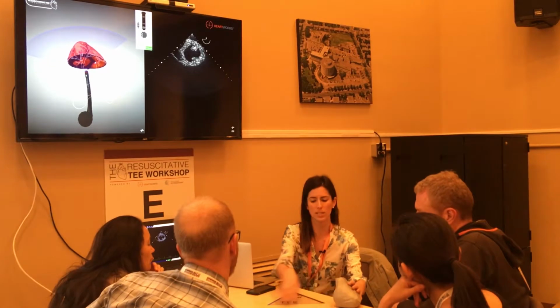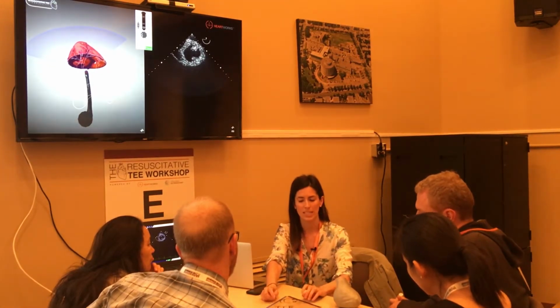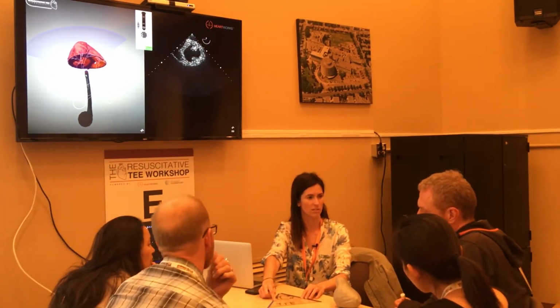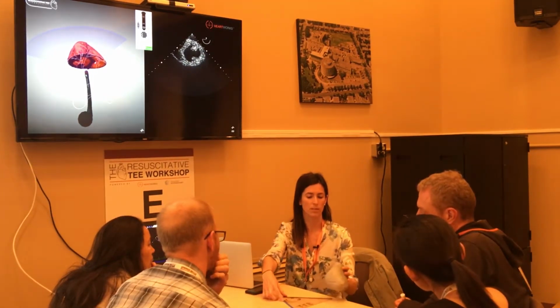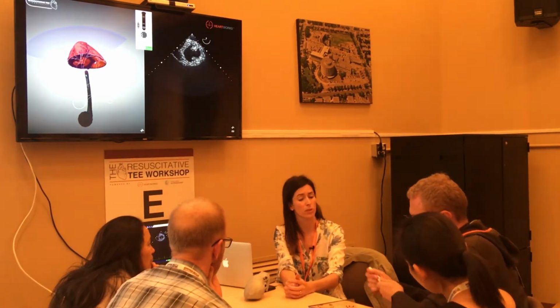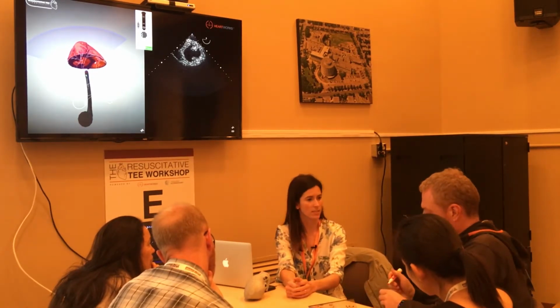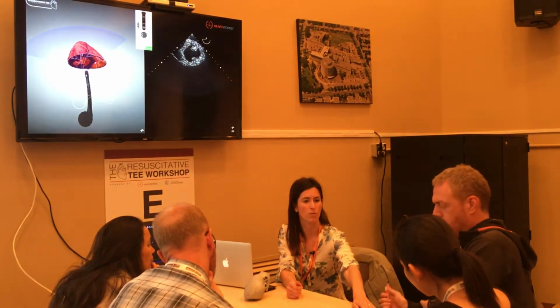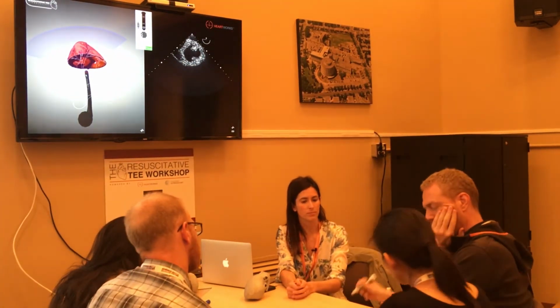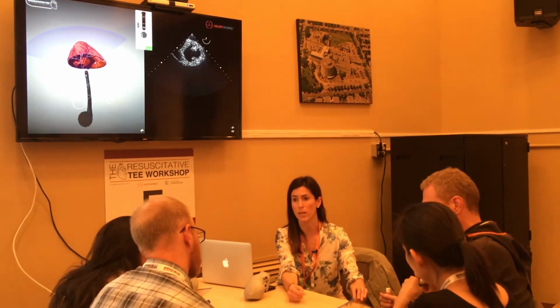Okay. What makes this confusing is that we see this exact same image in transthoracic echo. So will you label the anterior wall in a transthoracic view? Exactly. And then inferior wall in the transthoracic. Perfect. And then lateral and septal remain the same.